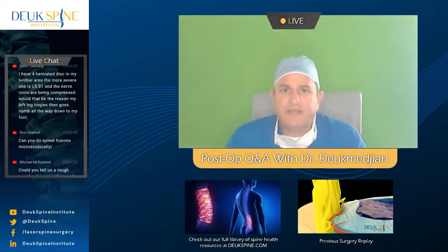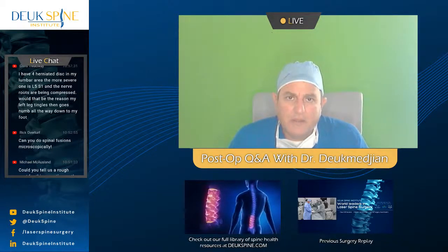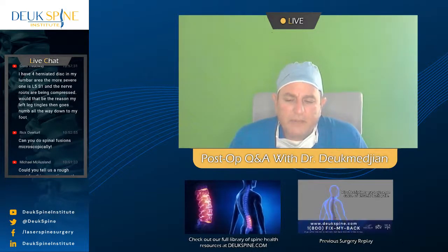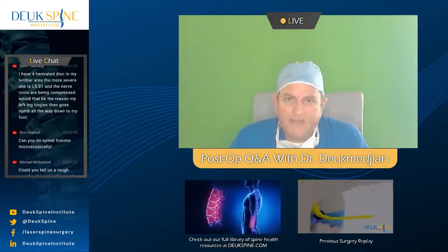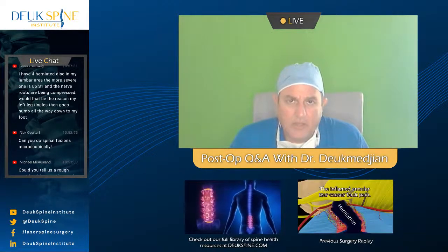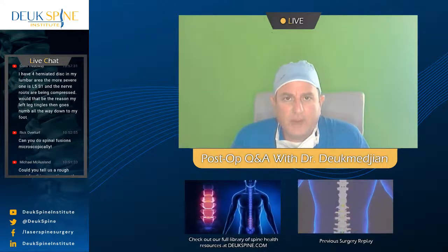If I do the surgery endoscopically, I can't do the Smith-Peterson osteotomy. It's just not possible. So why do a fusion microscopically or endoscopically? The real question is, why? What are you trying to achieve? What is your goal by doing it microscopically? Because by doing it microscopically, you're going to compromise the quality of the surgery. You're not going to have the same outcome or the same result. You're not going to get the decompression you need, the correction of deformity you need, and you're not going to get the best fusion result.